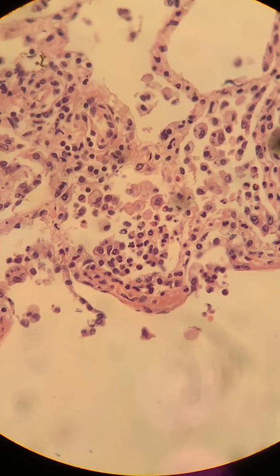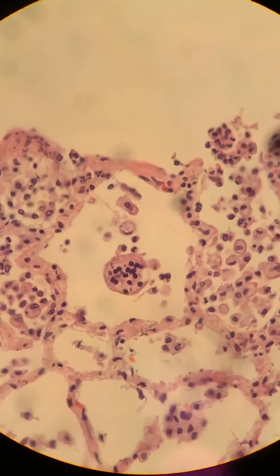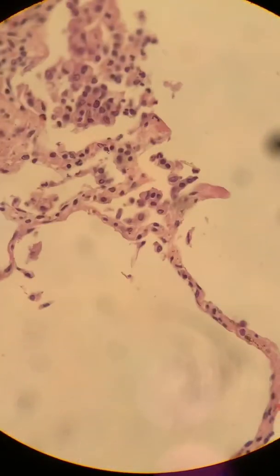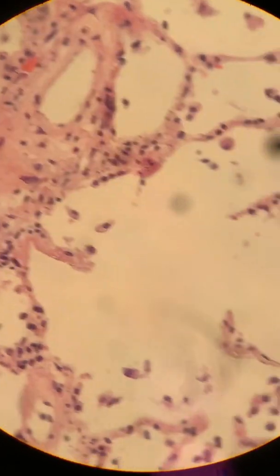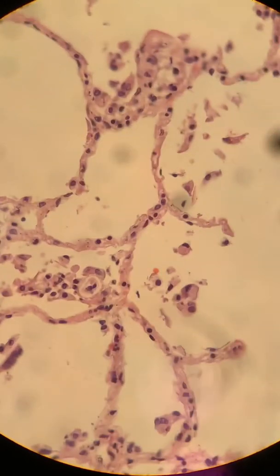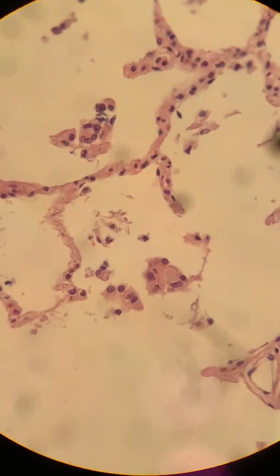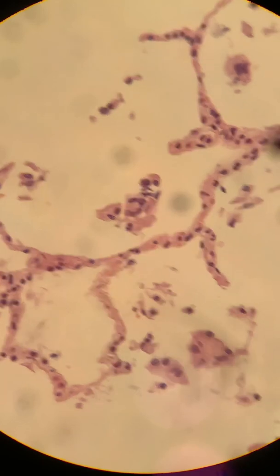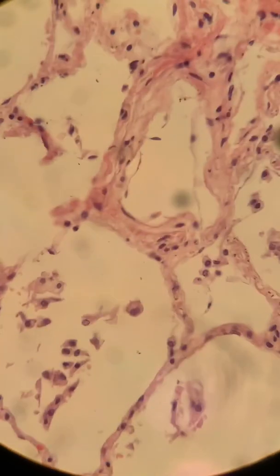Okay, you can see more acute inflammatory cells in alveolar spaces there. And there's a multinucleated cell there. But you can see the polys as well within the alveolar spaces. A little more foamy histiocytes than I would like to see. No, this is all a part of the inflammatory process, and there are some multinucleated cells there, and even there too. And alrighty.